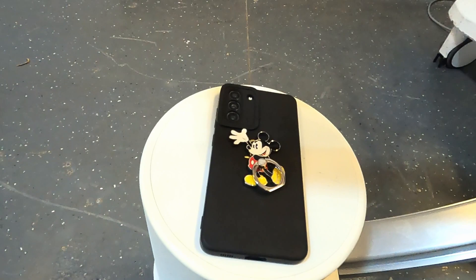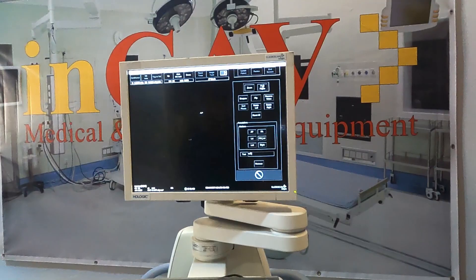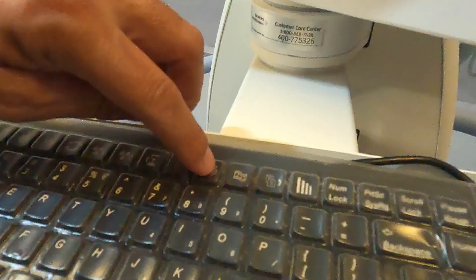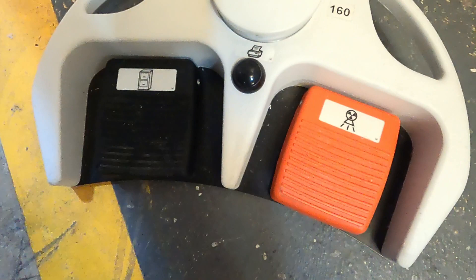We are going to do a second study and once again we're going to use our orange foot switch. You can see Mickey Mouse. To print, just press the print button on the keyboard or on the foot switch.